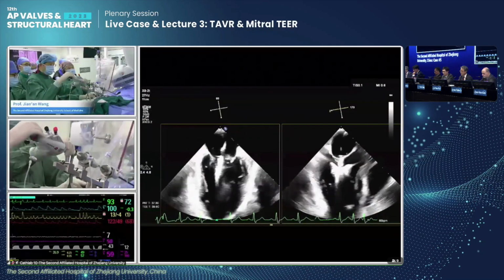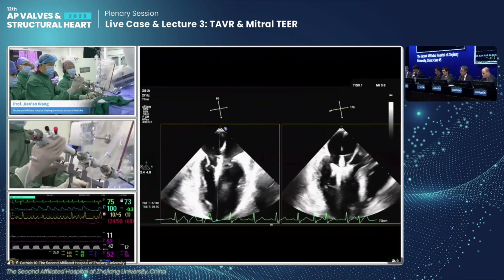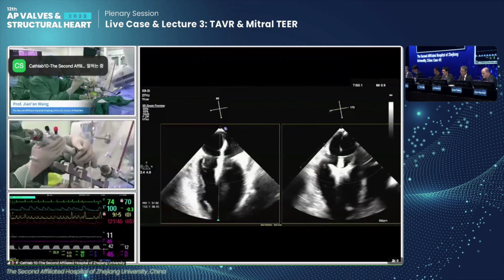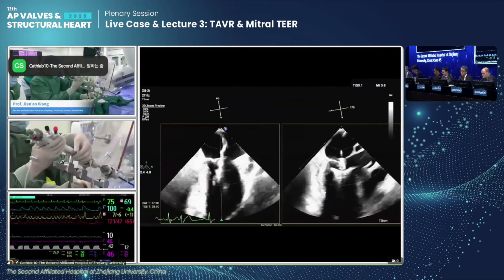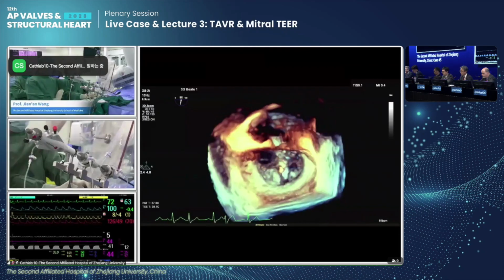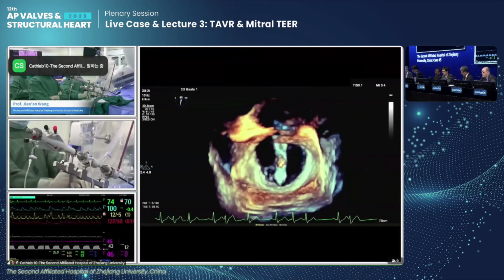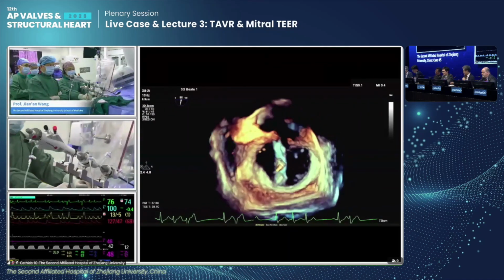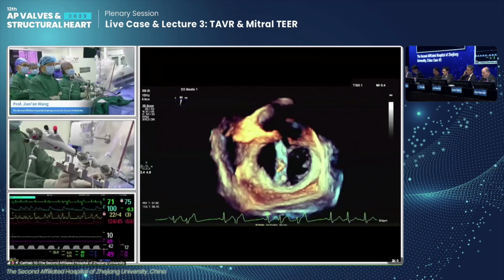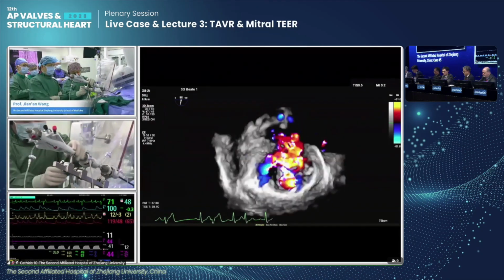Would you like to relieve the tension? Want to go back to 3D and see if your orientation's okay? 就看一下orientation，3D。You're definitely over some of the posterior. 整个系统再往外一点可能好一点，系统还是有这样下来的感觉。对我感觉就这样弯下来了，方向还可以。Stayed stable. 再看了打一打，possibly a bit clockwise.